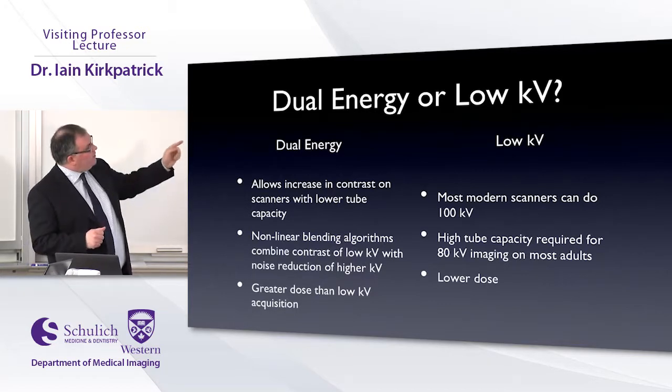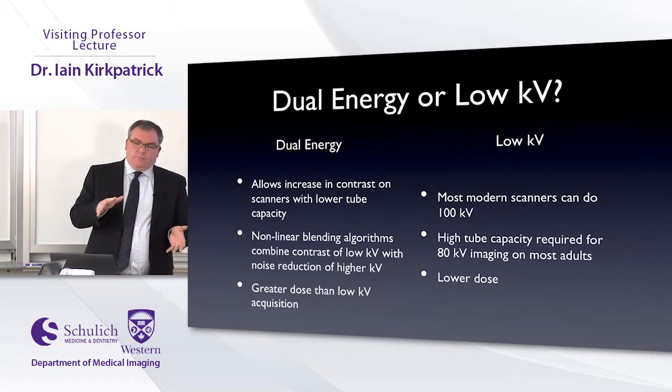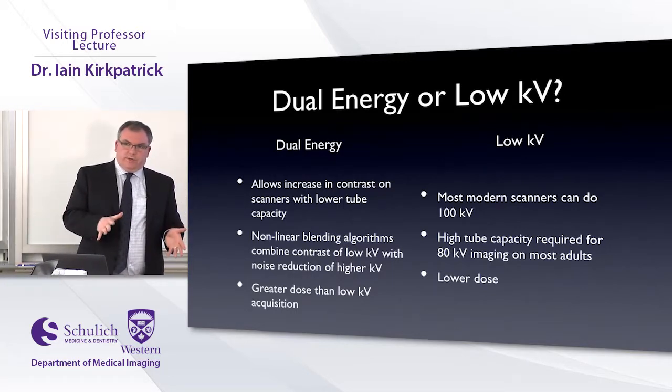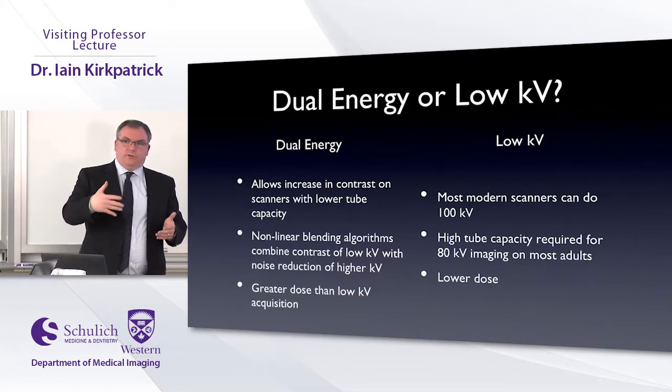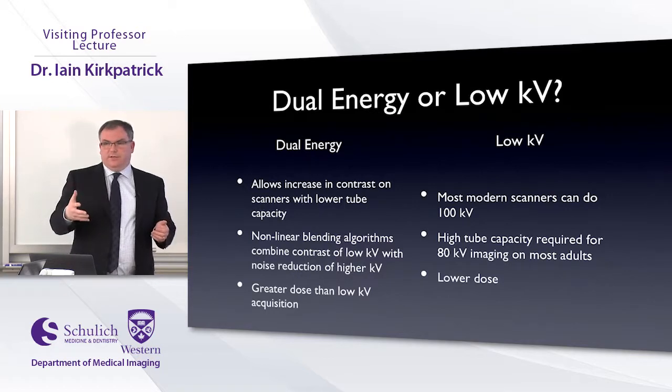But what we're doing a lot of the time is a dual energy scan. And then you have 2 options. You can do virtual monoenergetic reconstructions, and they'll be really noisy when you do that. But if you're just looking for bowel enhancement, that's okay. And then you switch to your other images, your blended images, for looking at everything else.